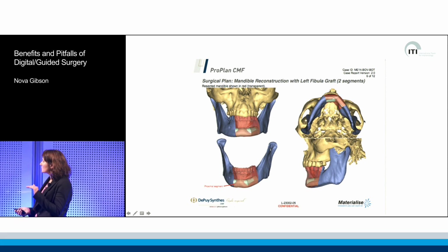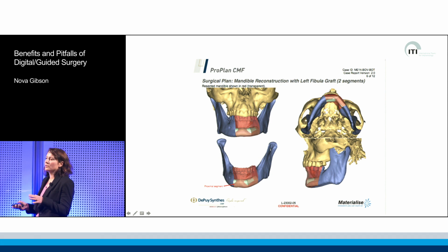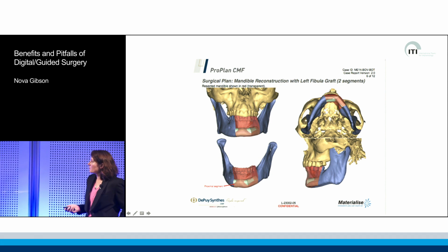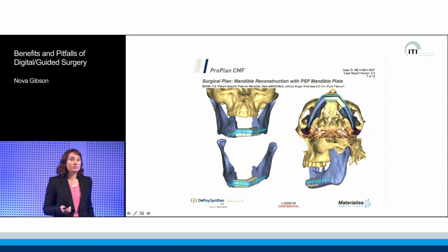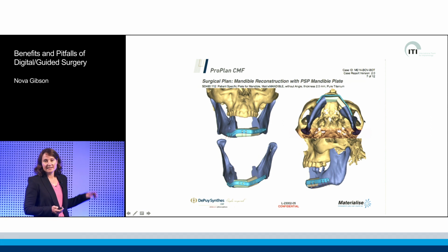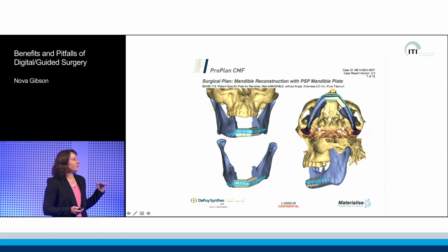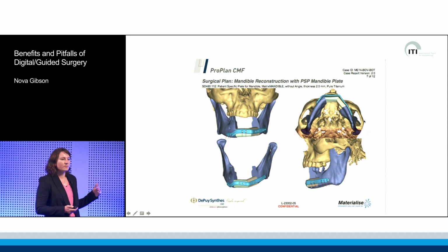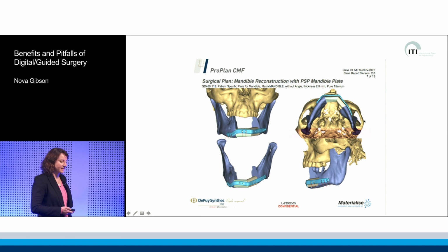And this sort of procedure is most relevant where you've got to get 2 bits of bone to fit together well. And then from that, the customised milled titanium plate that is custom made for him, and it fits specifically both where his mandible was and also in the neo-mandible where the fibula is as well.